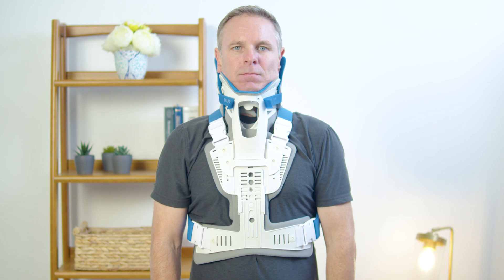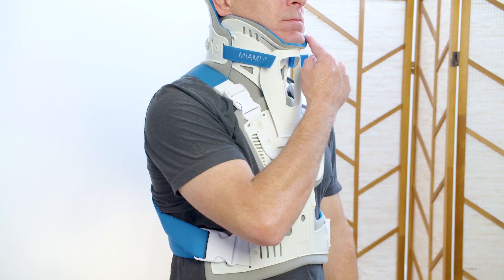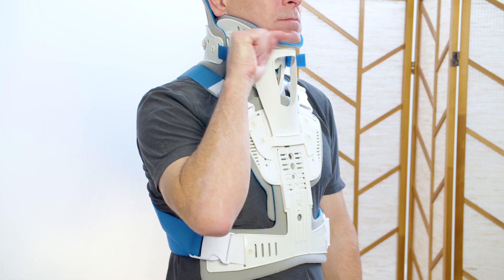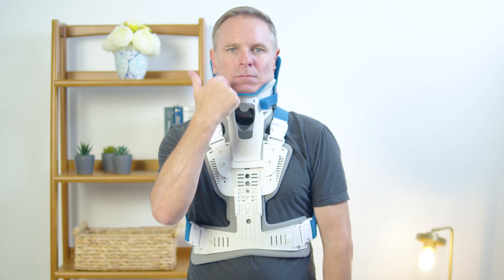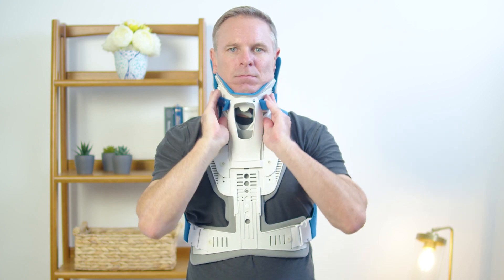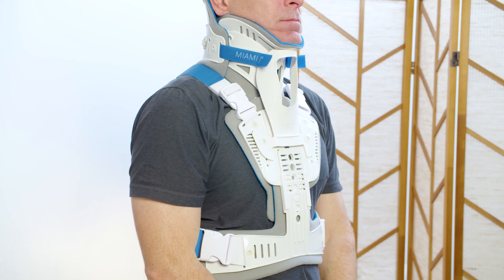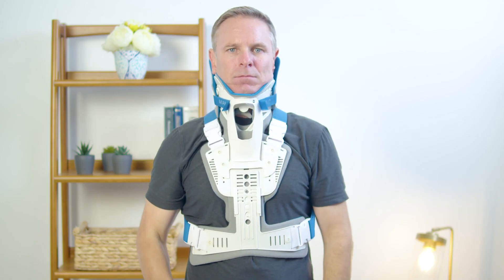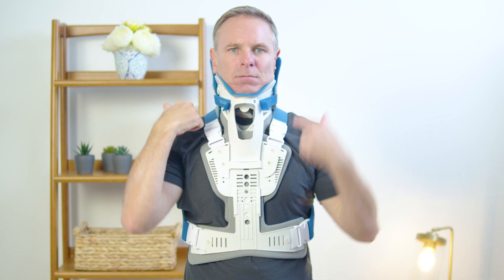A properly applied device will look like this: the chin is centered comfortably in the chin support and should not extend over the edge of the pad nor fall inside the collar. Hook and loop straps are equal length and aligned to the front adhesive sections. The front of the collar is angled up toward the ears.